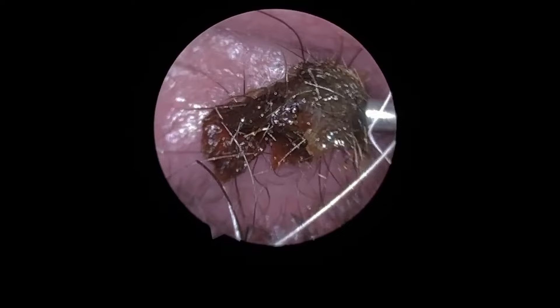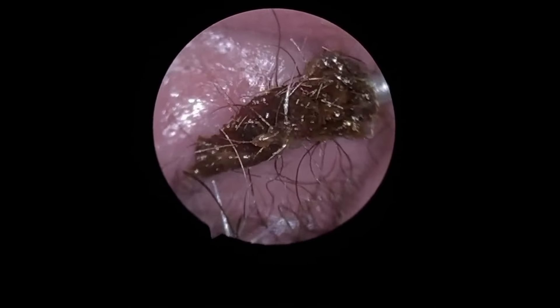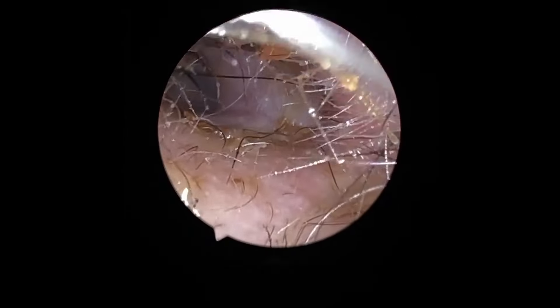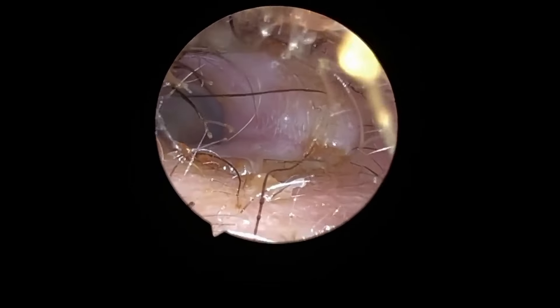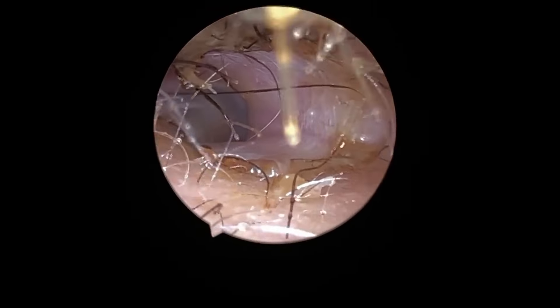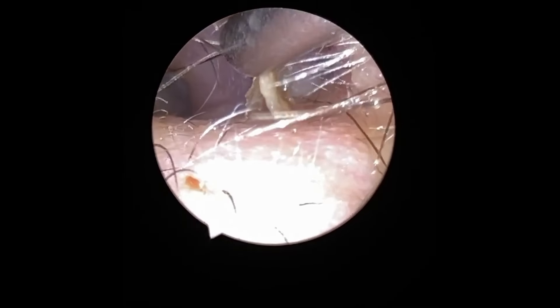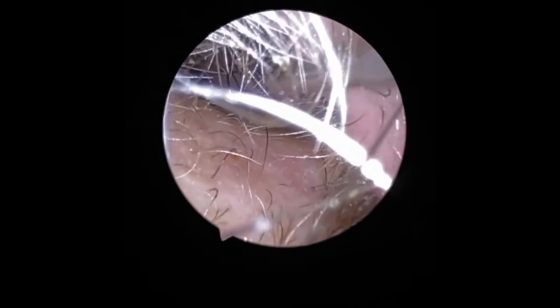The lighter parts of the encapsulated blockage are where the plug was attached to the ear canal wall. This ear had earwax removal elsewhere only a week and a half ago and it seems it may not have all been removed correctly, so Lord Tyrell was glad to have this out today. I now have a clearer passage to the eardrum but there is still lots of residue in the outer third of the ear canal, and here I'm removing that. These smaller bits can easily get into hearing aids, so I wanted to ensure all of this was removed as much as possible before his hearing device fitting.